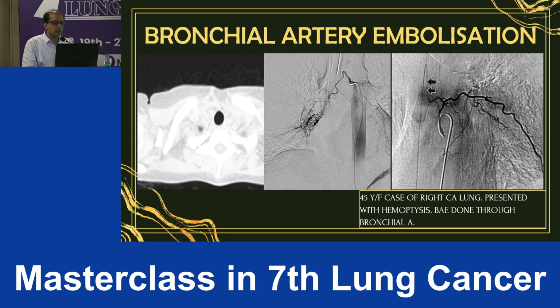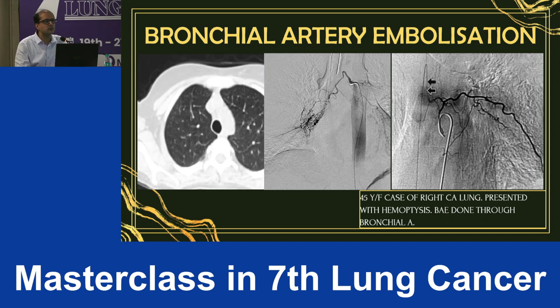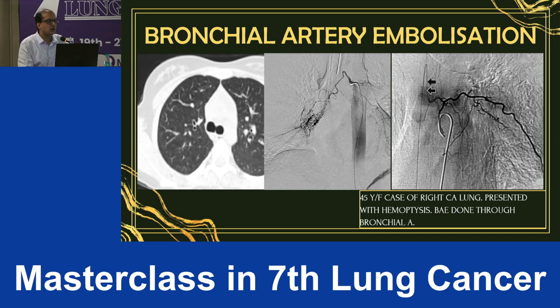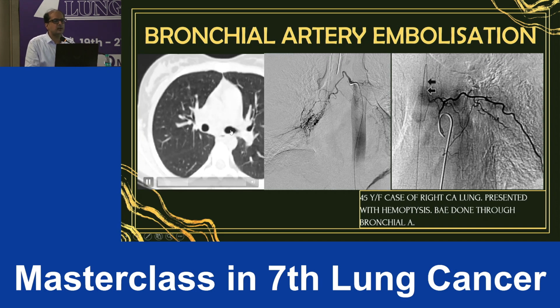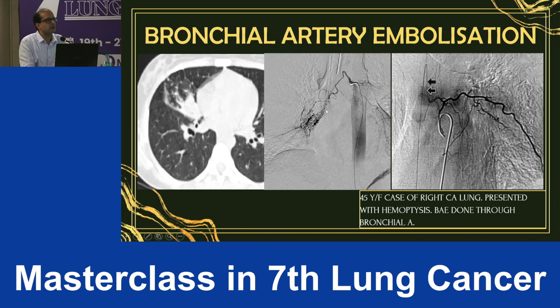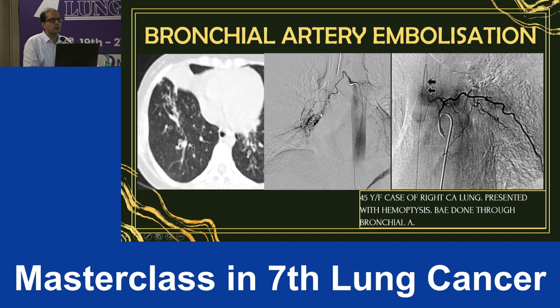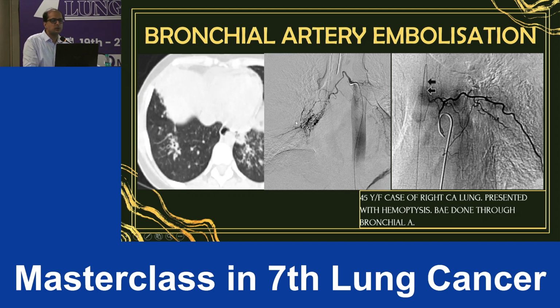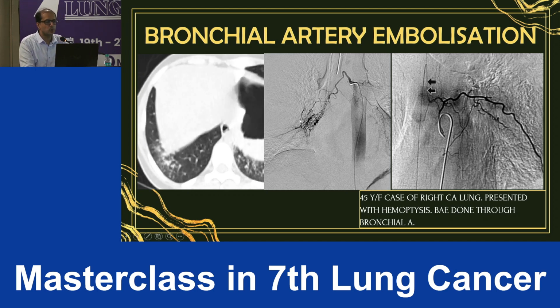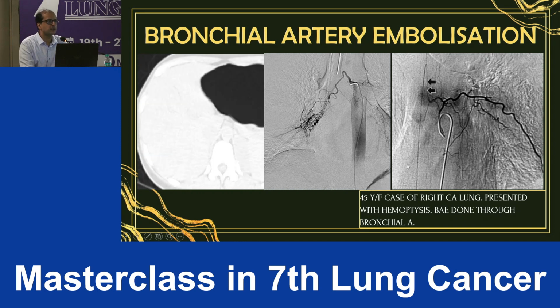Coming on to bronchial artery embolization, when the patient is having massive hemoptysis in case of carcinoma of lung, whether it would be a palliative intent or a curative intent, the techniques and the method remain the same. We always embolize with the help of polyvinyl alcohol particles. So what we see, this is the mass and this is the embolization which is carried out. We see multiple tortuous vessels arising from the bronchial artery on the right side, and this is what I would need to highlight to my radiology colleagues.